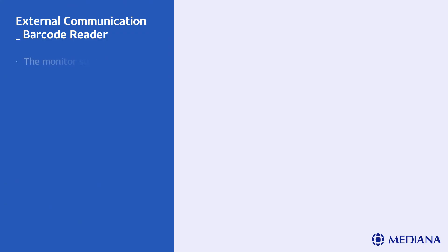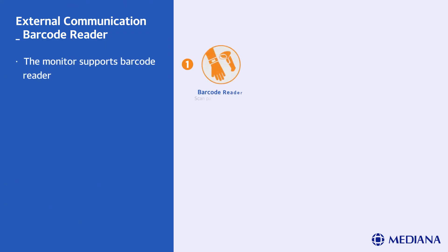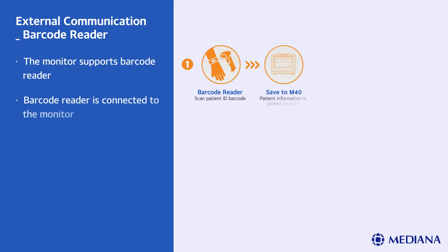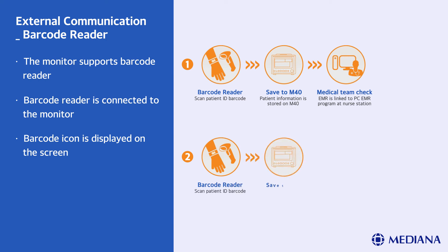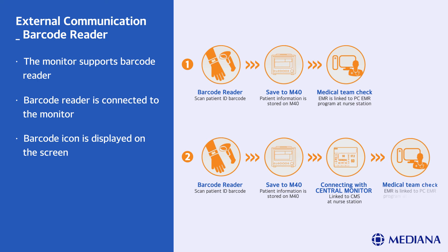The monitor supports barcode readers. When the barcode reader is connected to the monitor, the barcode icon is displayed on the screen. Users can enter the patient ID using a barcode reader. Product settings and serial number can also be entered with a barcode reader.